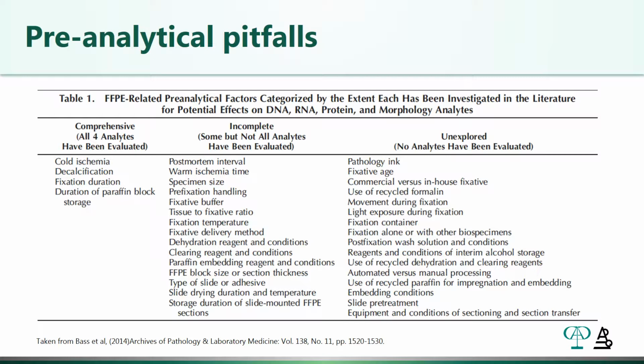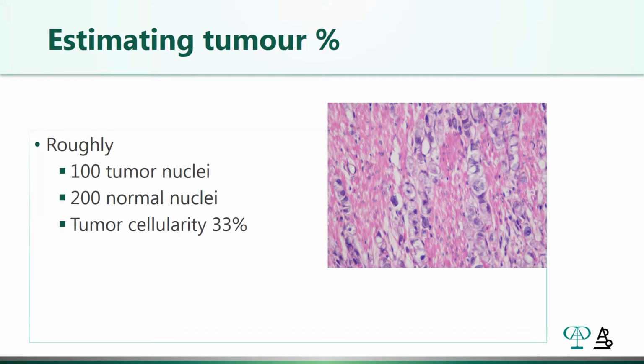And so the take-home message from this is that although we recognize that the sample and its processing and everything about it is really part of the pre-analytical parameters that we need to think about, many of these parameters are things that we really never get a chance to look at, but they may actually impact the quality of how your assay performs. And you should at the very least be aware of them, even if you can't control them at all.